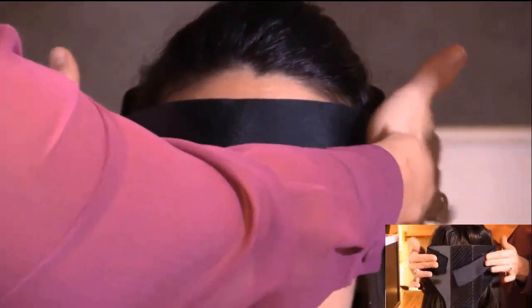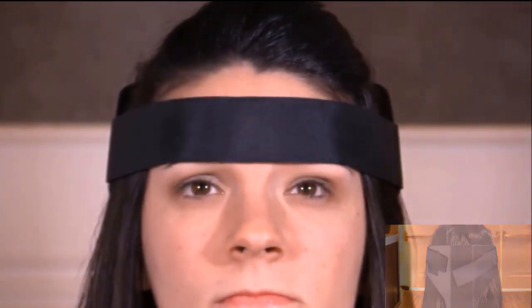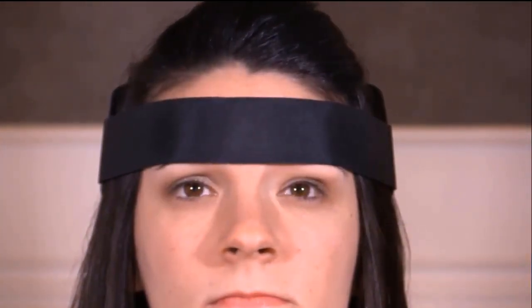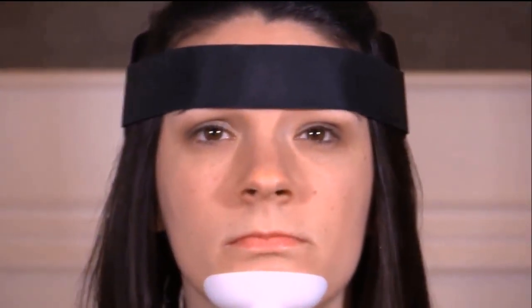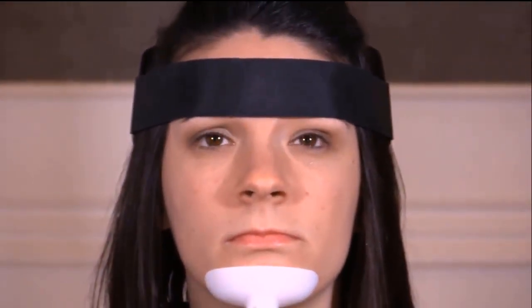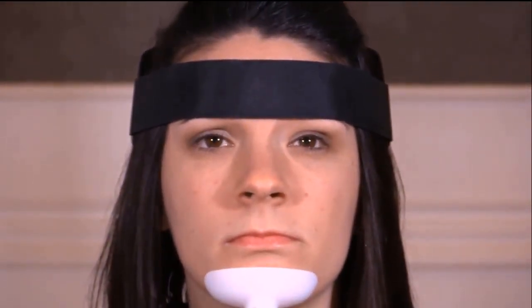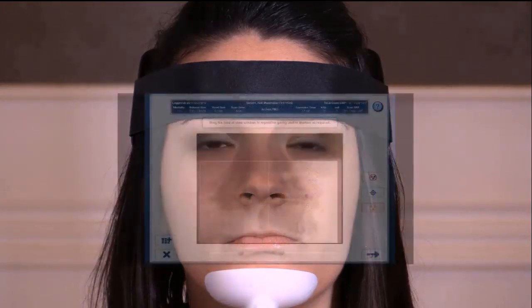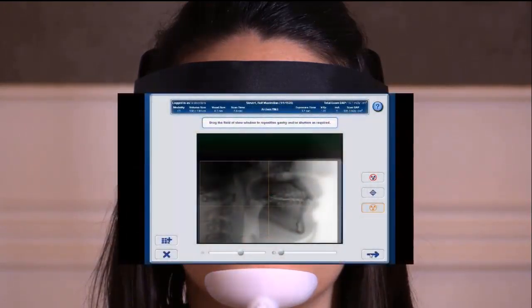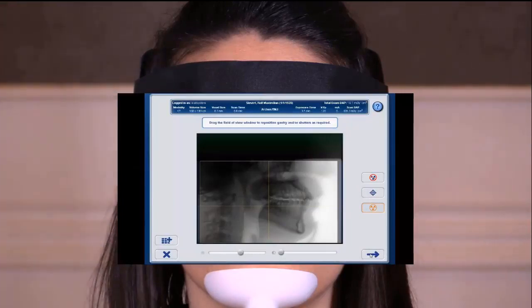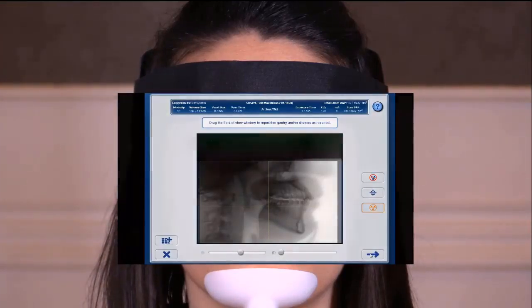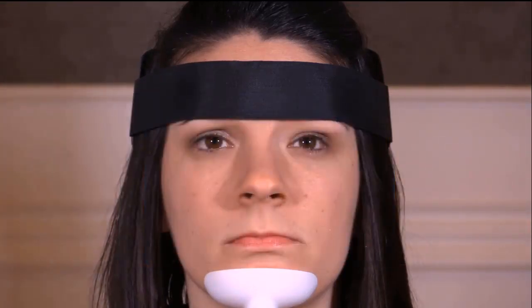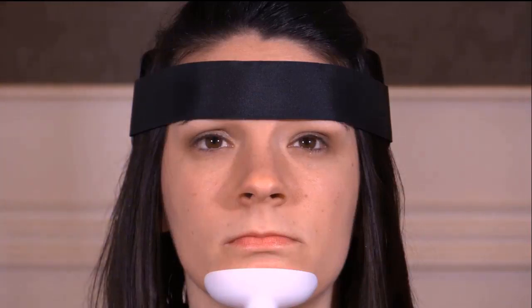Now we want to take a preview image — a scout — to make sure that our patient's position is good, as well as that we have all the anatomy that we're trying to acquire in the image. So we're going to go ahead and take a scout view. Our patient's scout view looked great.